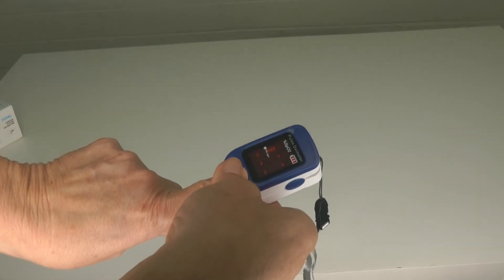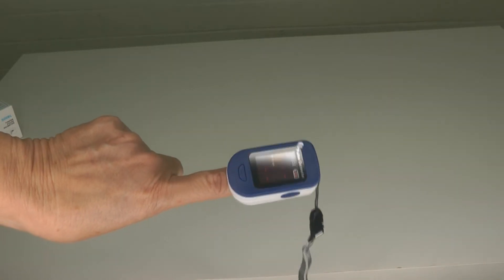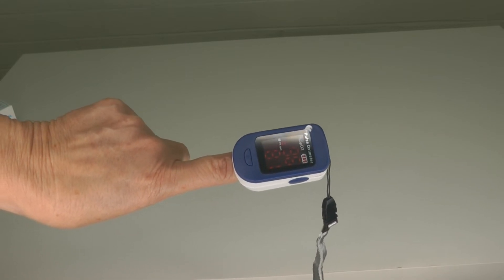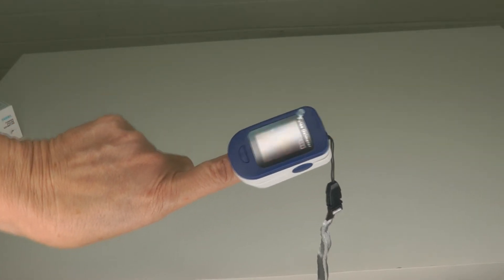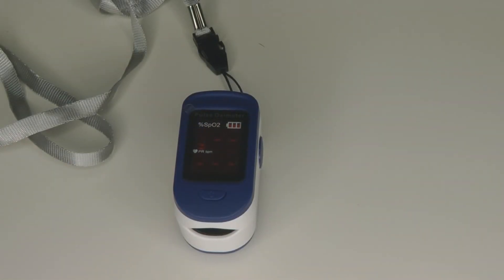The reading appears within 10 seconds, then the device will power off automatically in about 8 seconds when your finger is removed and no signal is detected. Make sure your finger is inserted deep into the chamber so the fingertip is placed directly between the LED sensor and the LED light source.